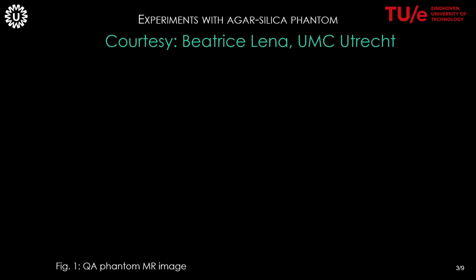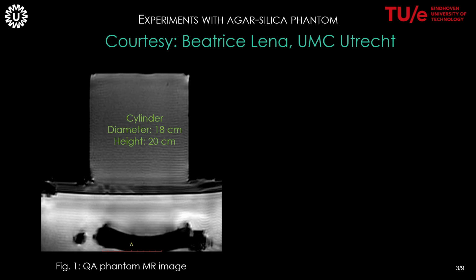As a first step for validation of the model's ability to simulate fluid materials under HIFU, we have set up an experiment with a quality assurance phantom together with the University Medical Center in Utrecht. Here you can see an MR image of the cylindrical phantom. The phantom contains agar and 2% silica.